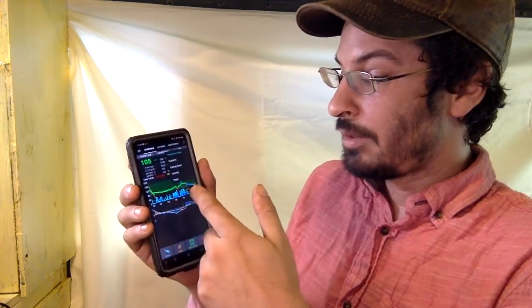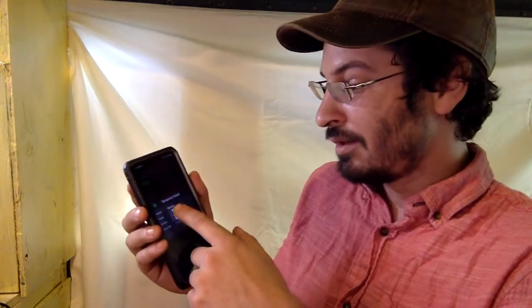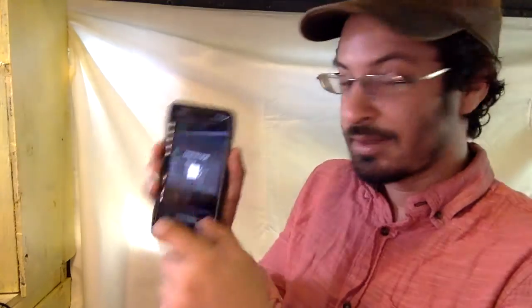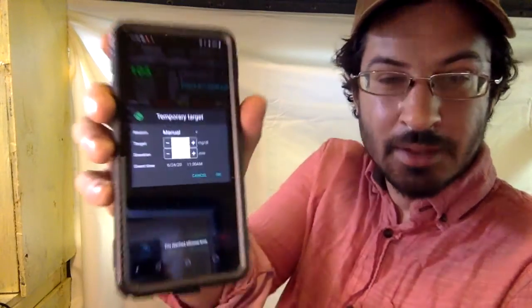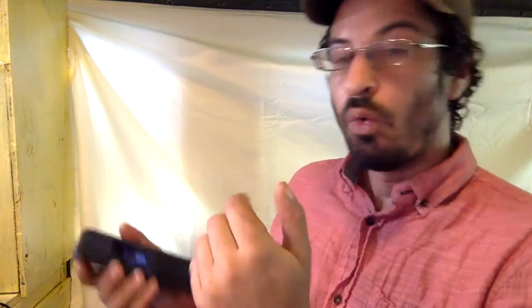And then this 90 up here, I hold this, and it's temporary targets. So I can be really crazy here, I can tell the system, oh, you really can't see that, make a target of 72 milligrams per deciliter. Or say you're going to exercise, you can set your temporary target to 140, right? So that's the main thing.